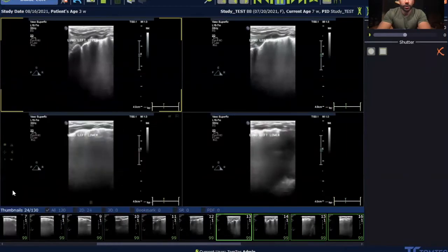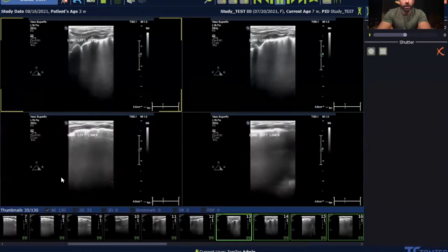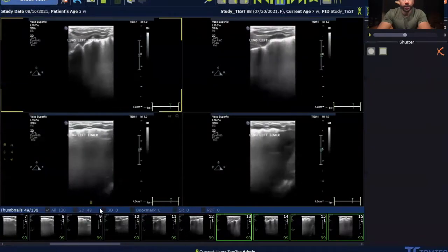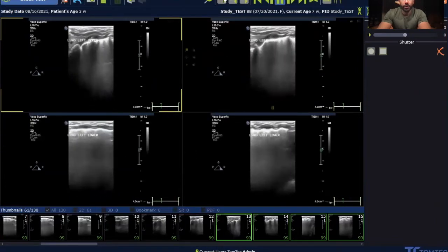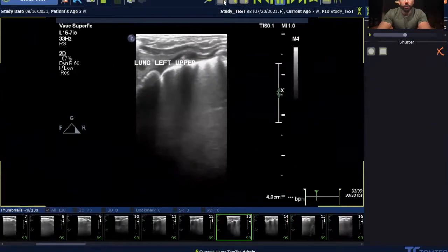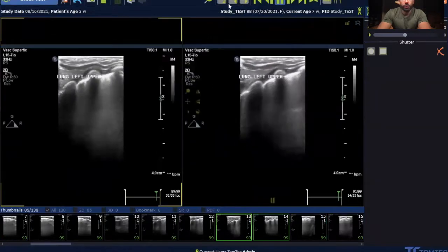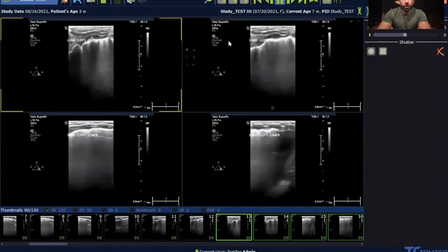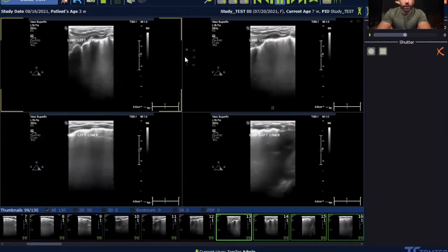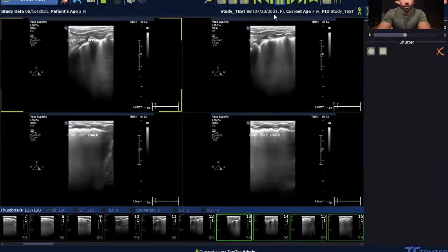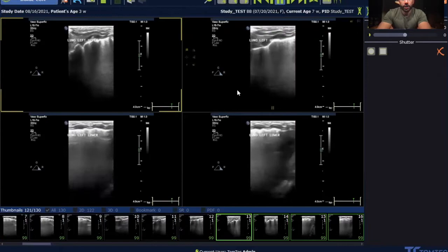As you can see, in these panels there is first the thumbnail. There are 130 clips in this study currently being loaded. As they load, you can see the format is set to four panels. You can switch to a format of one, two, or use two side by side, but we will be using four. You can pause and advance on a frame-by-frame basis, or play the clips that are recorded.